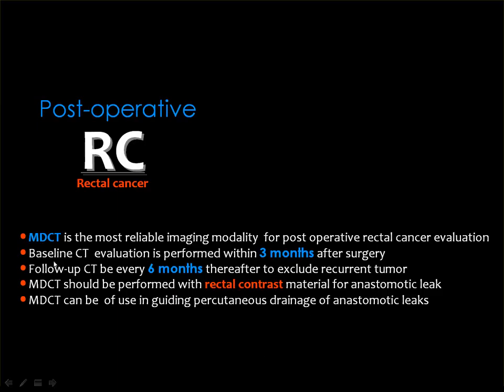Then you should have a baseline CT performed 3 months after surgery, and follow up every 6 months thereafter to exclude the tumor recurrence. Also, the multi-detector CT should be performed with injection of contrast material inside the rectum if you suspect anastomotic leak.